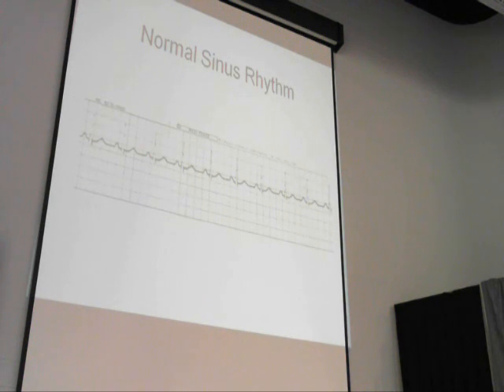Well, that's the PR interval. The PR interval is the time. Just the P wave itself, what does that mean? Atrial depolarization. Okay? QRS, or as one student told me, the little funky thing in front of the big pointy thing. But the P wave is atrial depolarization. Anytime you see the word depolarization, that's the electrical stuff. Depolarization, repolarization, those words all deal with the electrical component. So anytime we see a P wave, that means atrial depolarization. The QRS complex tells us about ventricular depolarization.